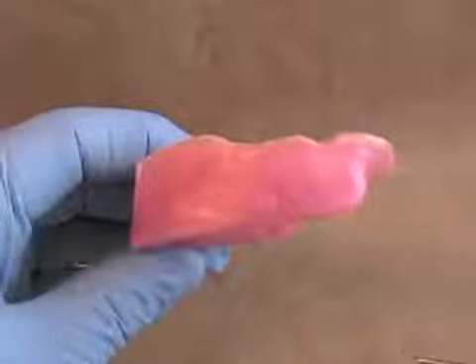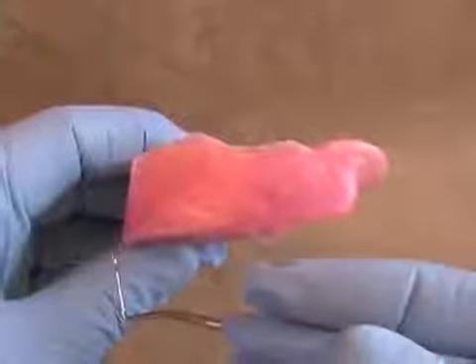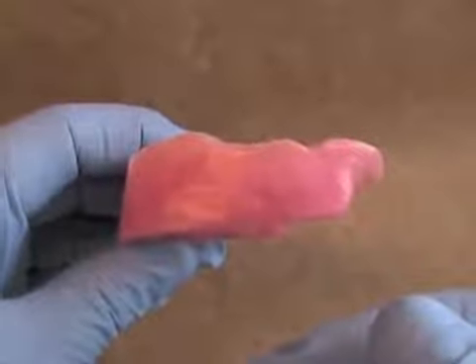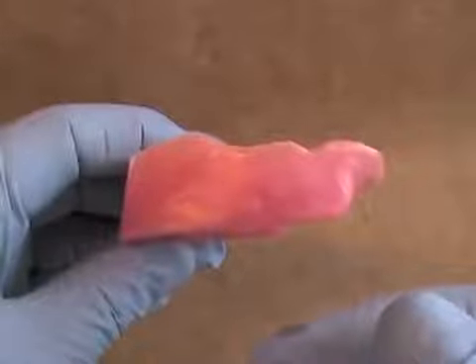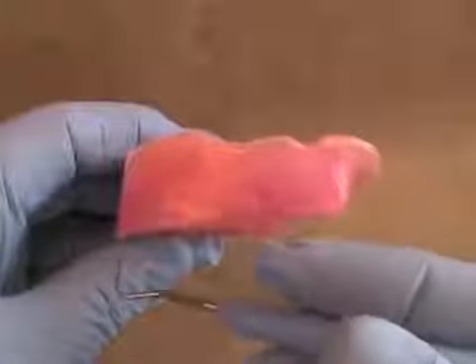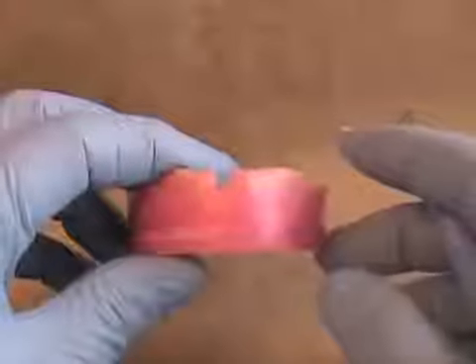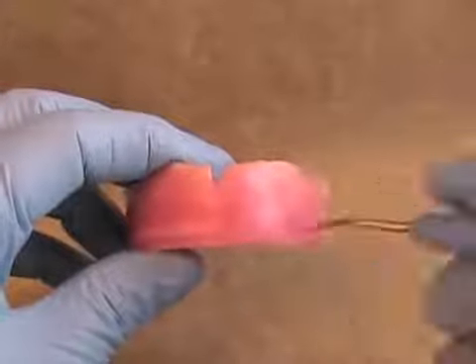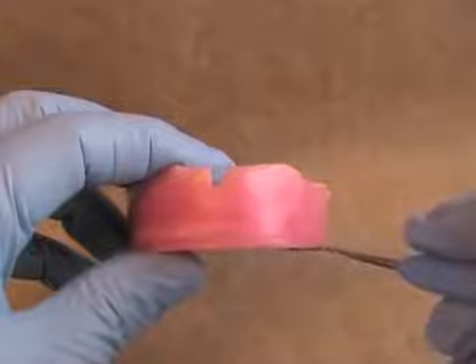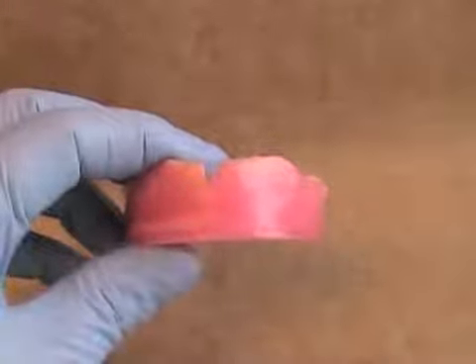When we place the maxillary rim intraorally, we expect to see a couple of things. First of all, the incisal edge of the rim should fall 1 to 2 millimeters below the upper lip when the patient is at rest. When the patient says the fricative sounds, the F's and the V's, the edge of the rim should just touch the wet line of the lower lip. When you're looking directly at the patient and you can see the rim just below the lip, the angle of the occlusal plane on the rim should be parallel to the patient's interpupillary line.